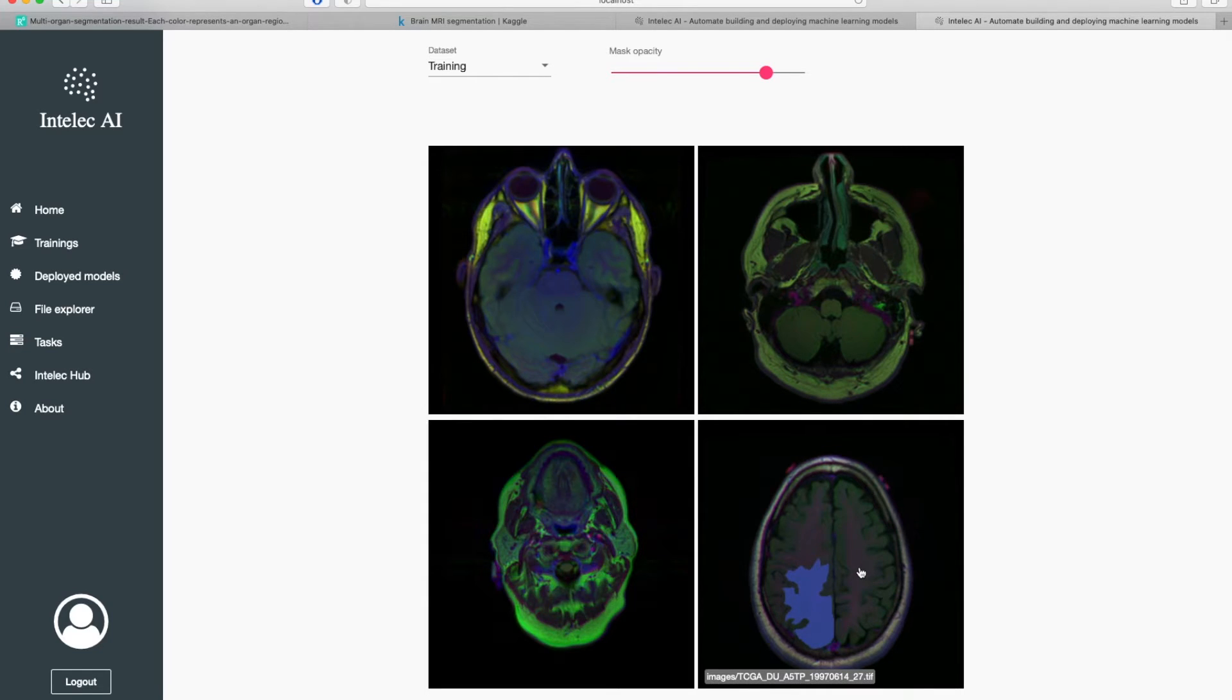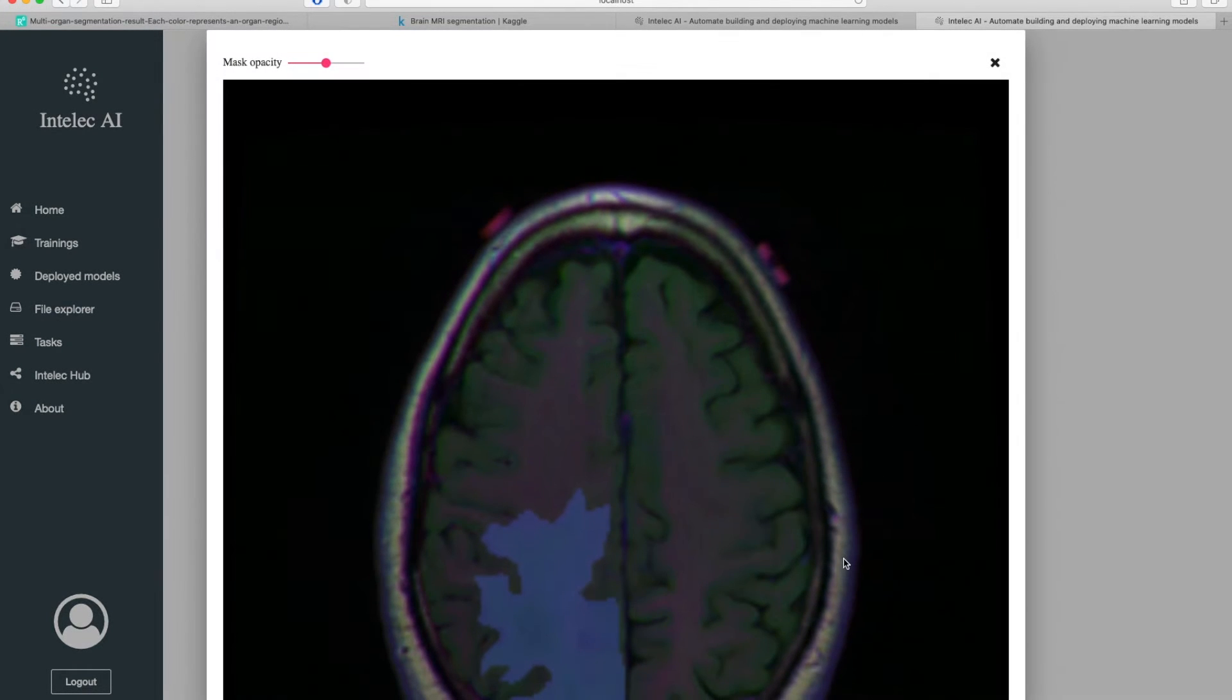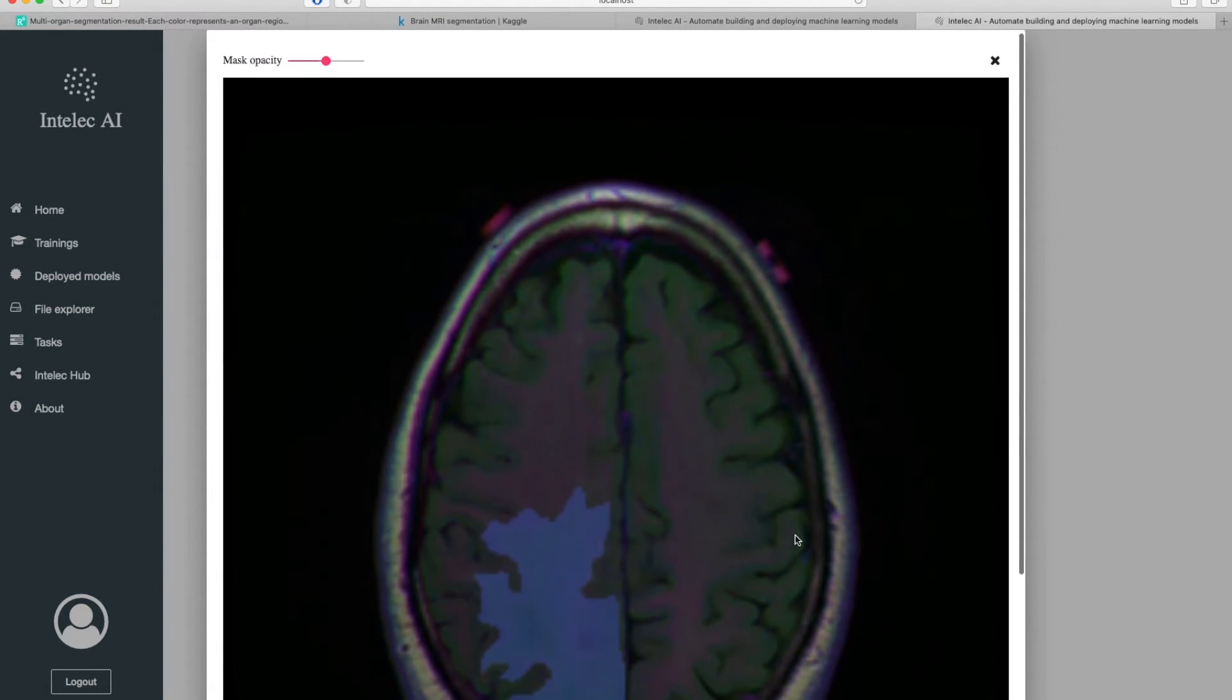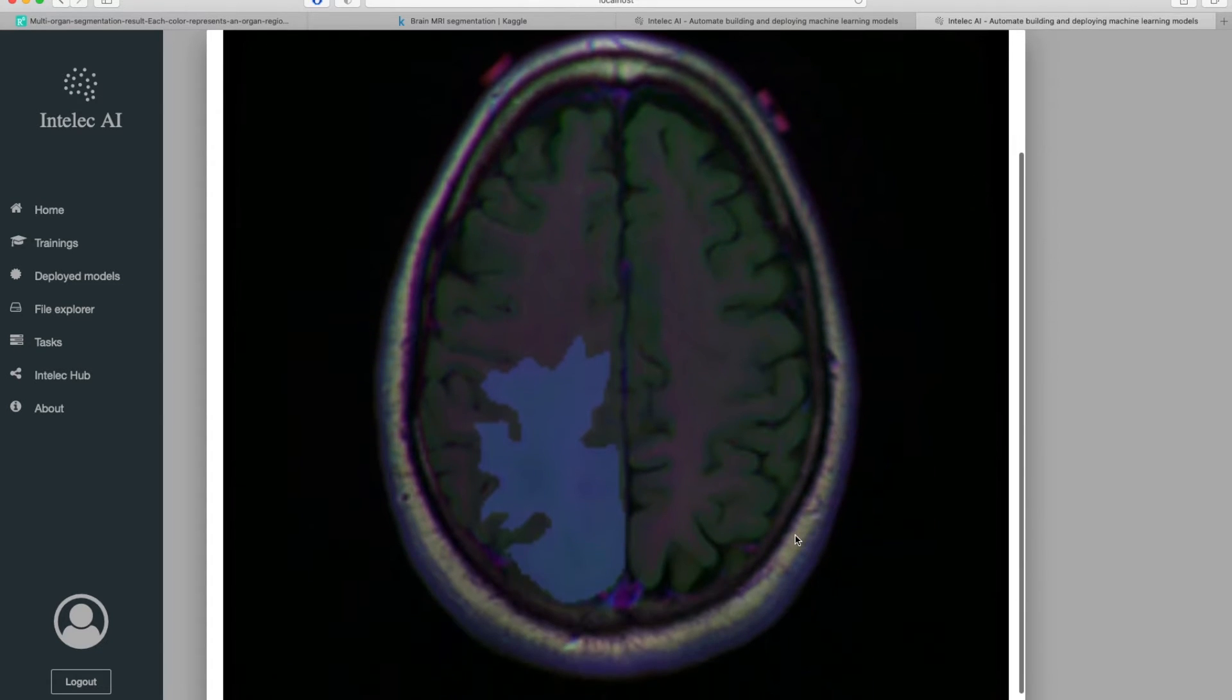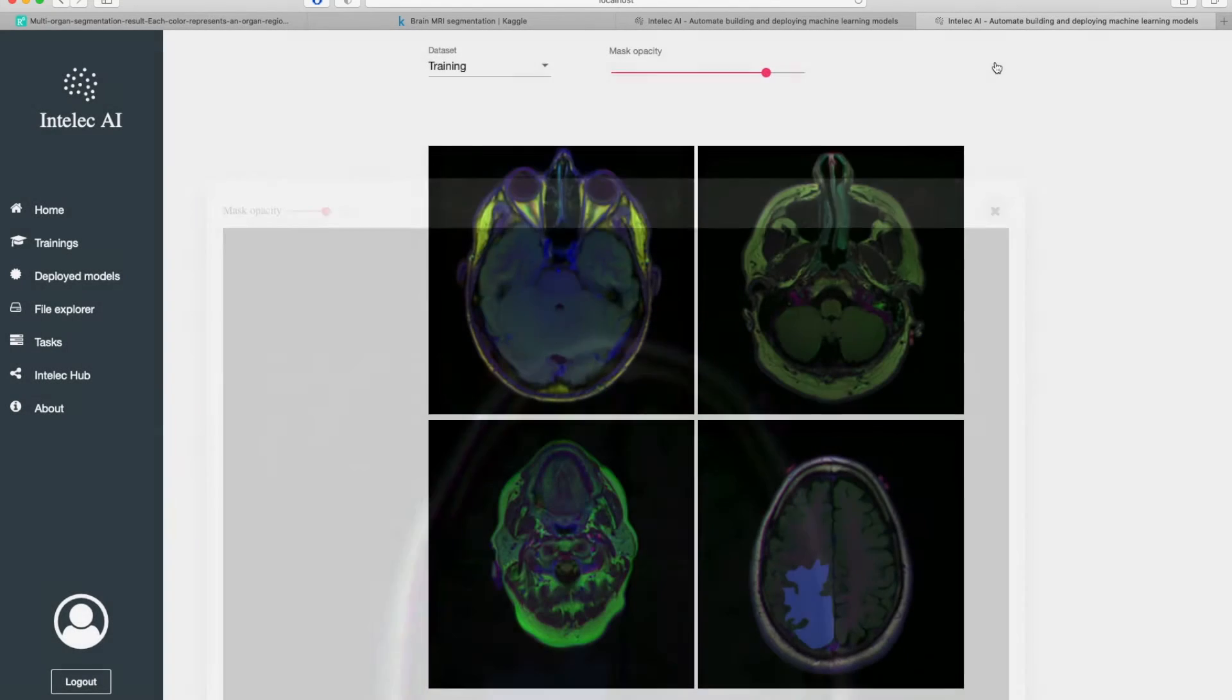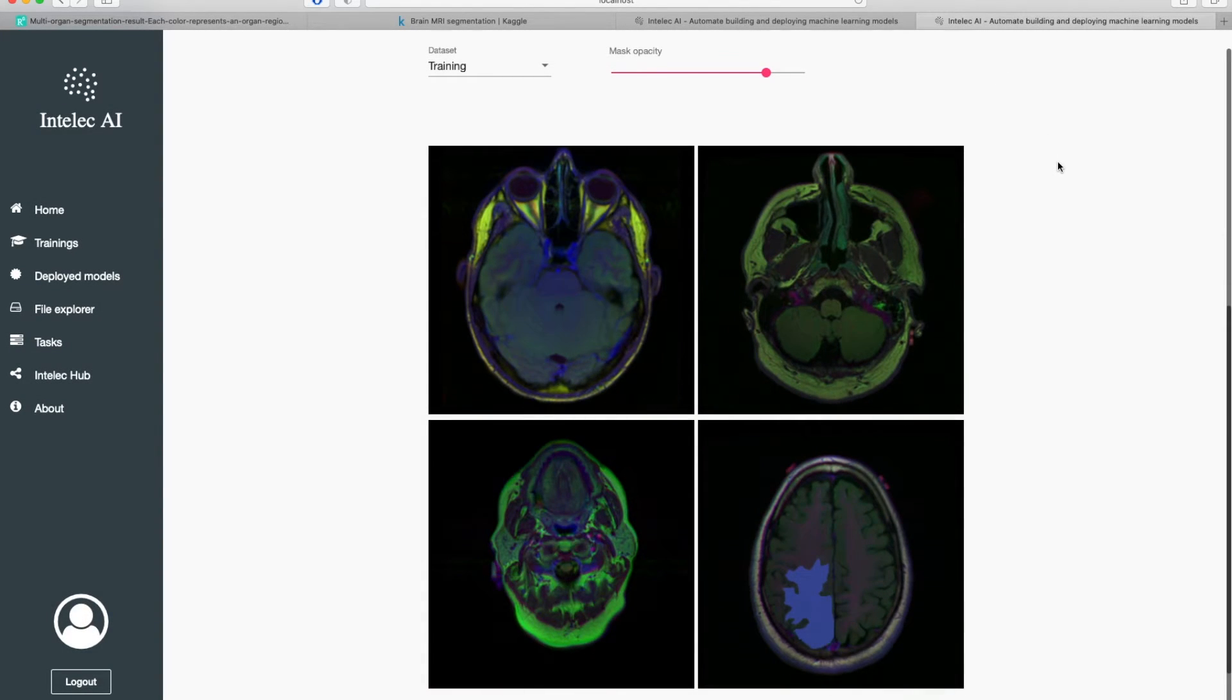If you want to have a close look, you can actually enlarge the images and check it like this. So it's a cool feature here from Intellec AI.